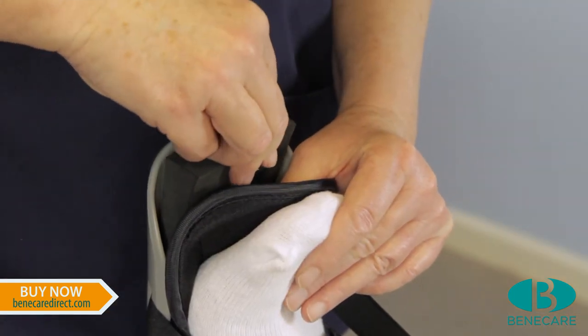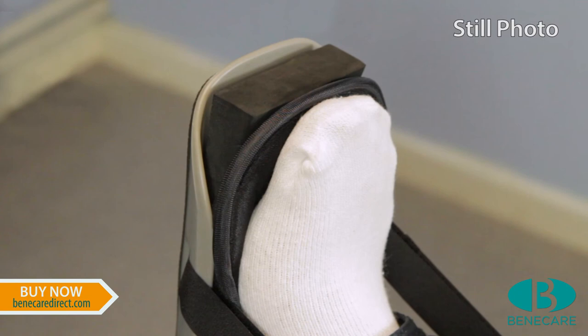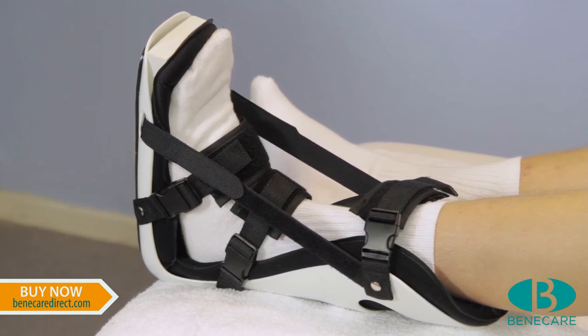Depending on the indication, the toe wedge can be placed between the liner and the shell to provide an additional stretch to the soft tissues. This should be positioned flush to the end of the splint. The splint can be applied easily by both clinicians and patients.